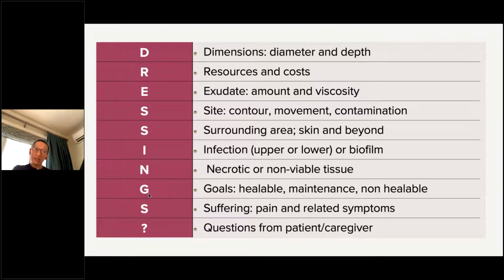Site, yes, I think especially with pressure injury, you do need to consider the contour of the location. With most of the pressure injuries being in the coccyx and sacral area, it's a big challenge for us to come up with the correct and appropriate dressing to cover the location.